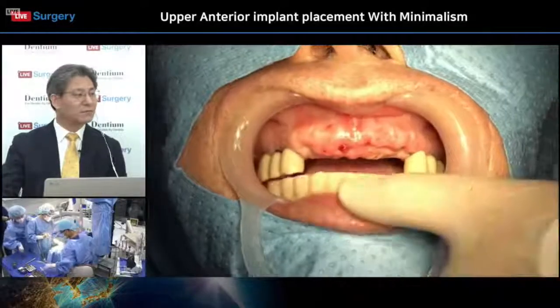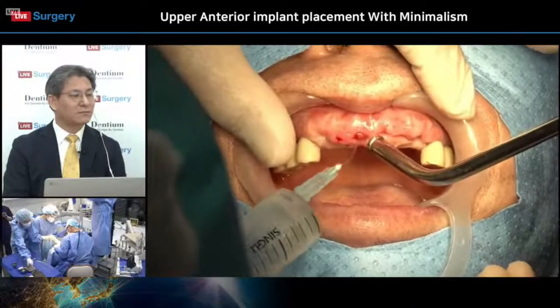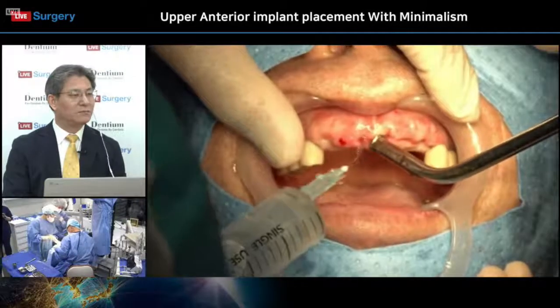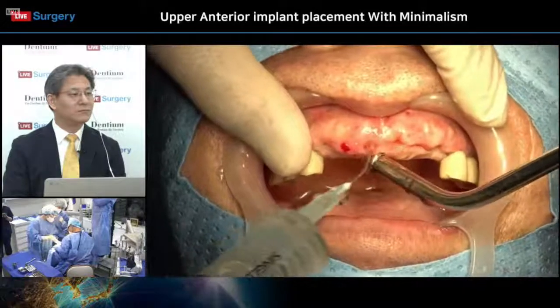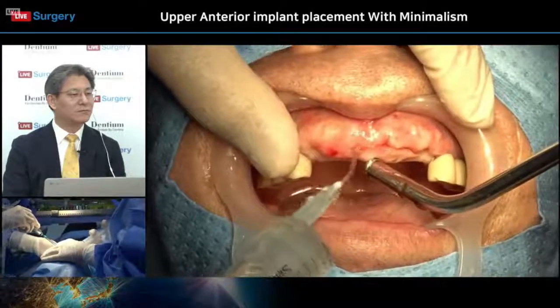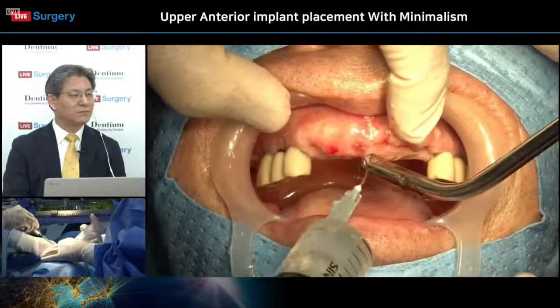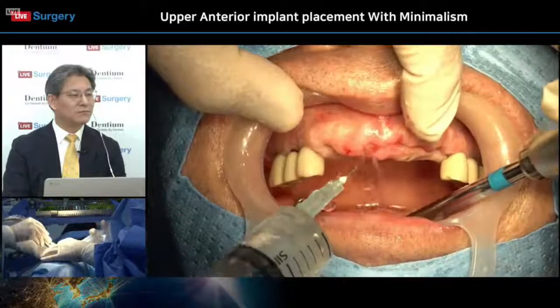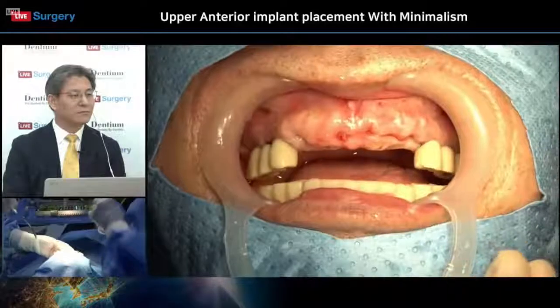I don't know about the fistula on this side after extraction at the time of the filling process. So I tried irrigation with chlorhexidine. But this side is not related to the fistula, so I will try to do the surgery.